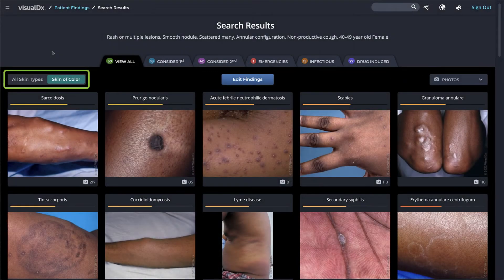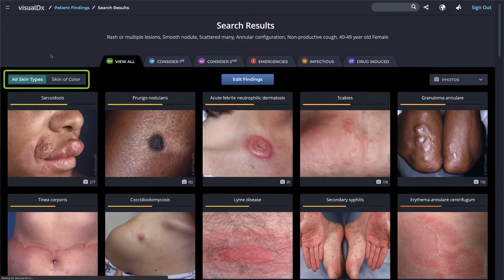Since our patient is a person of color, we have the Skin of Color toggle turned on. However, we can easily switch to All Skin Types to see a variety of skin types in our differential view.